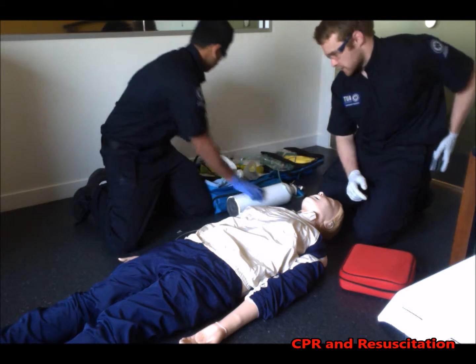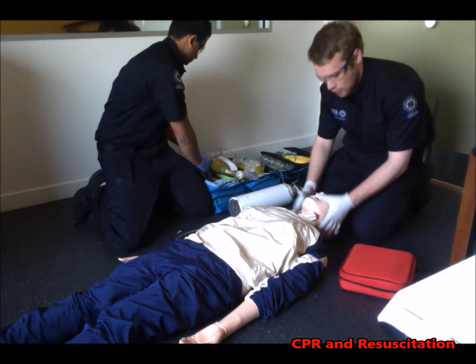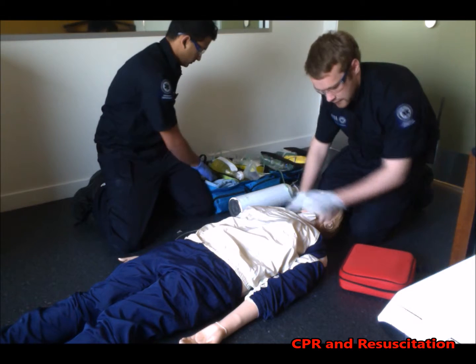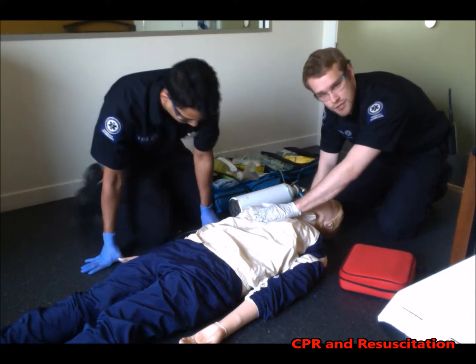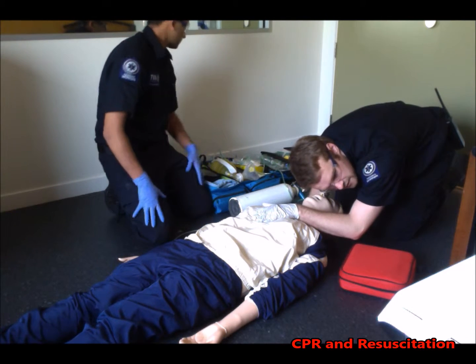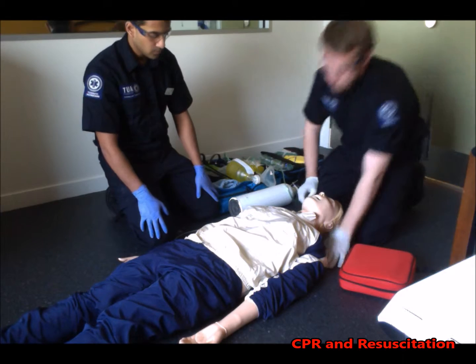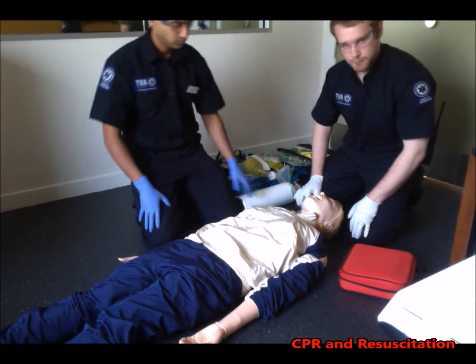Next, we want to check his airway. So I want to see if that's all clear. We will insert an OPA. So I have that ready. Next, I want to just listen for any signs of breathing or feel for chest rise for 10 seconds. So still no signs of breathing and no chest rise, so we'll have to potentially start CPR.